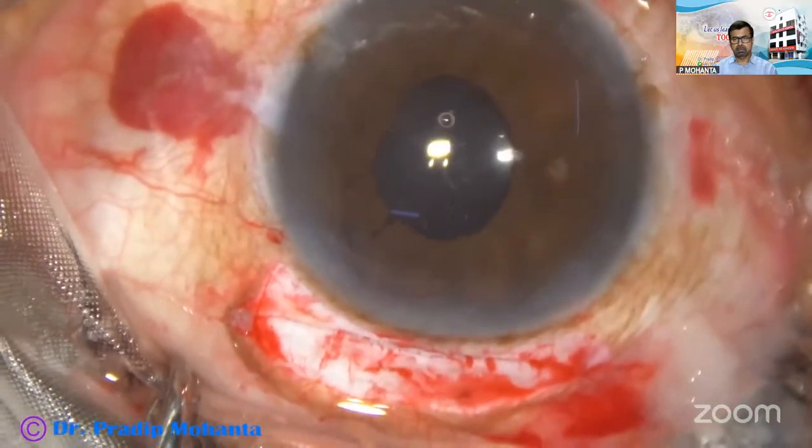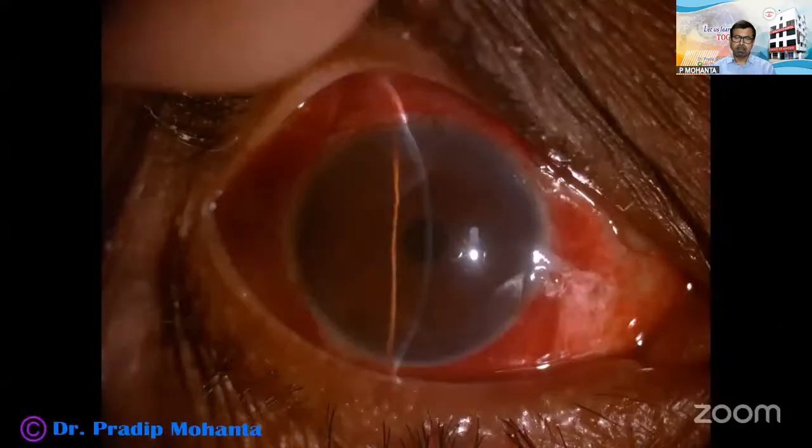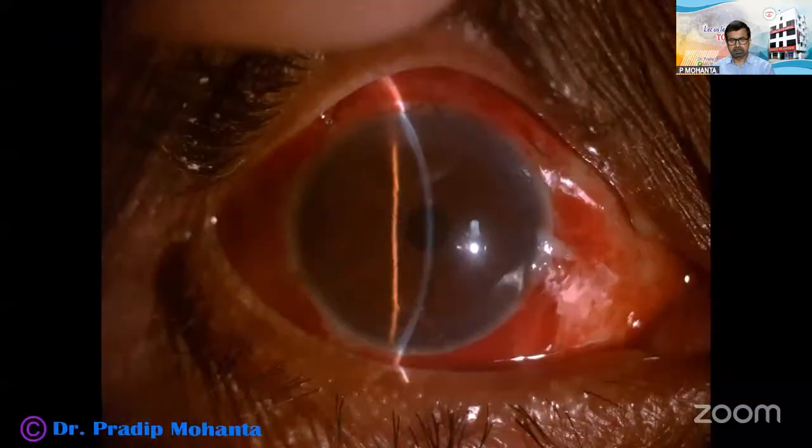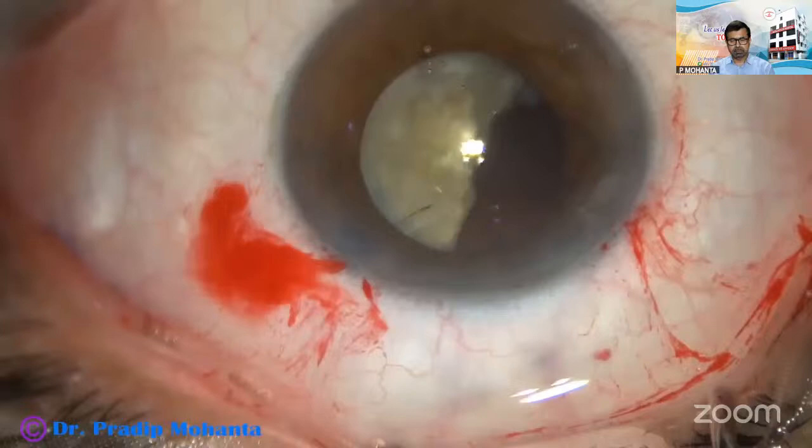And the patient did very well in the postoperative period. These are the postoperative pictures. There was very mild corneal edema.